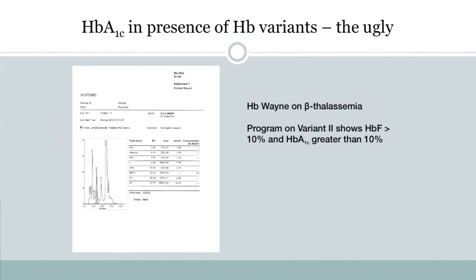A1c in the presence of hemoglobin Wayne — the ugly. We published a paper on this in Diabetes Care and wanted to call it 'Welcome to Wayne's World,' but weren't permitted that title. Wayne is really difficult to pick up. It shows a hemoglobin F-like band because Wayne 1 co-elutes with hemoglobin F, and Wayne 2 co-elutes with hemoglobin A1c. This creates significant challenges in detecting this variant, although the D-100 is set to pick it up — even if it cannot specifically identify it as hemoglobin Wayne.